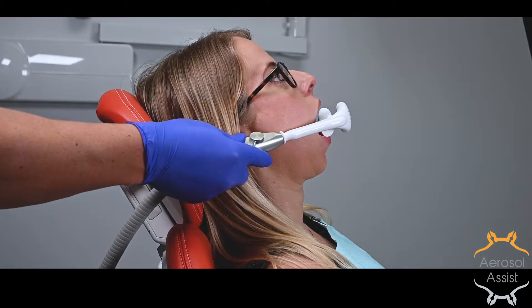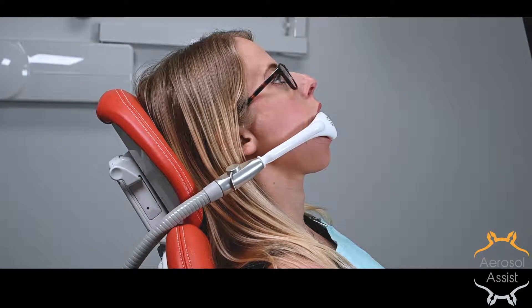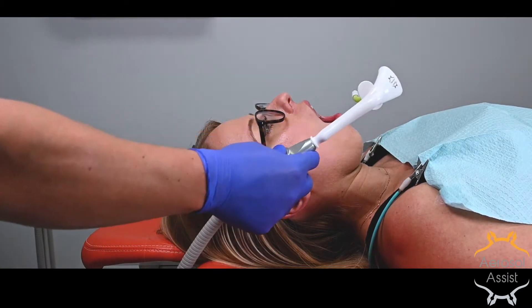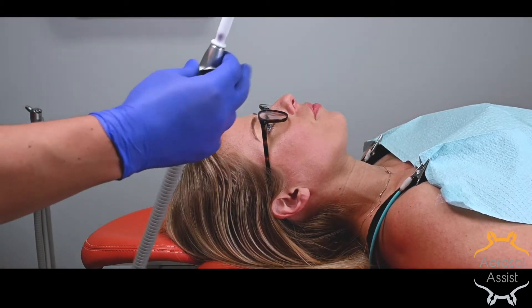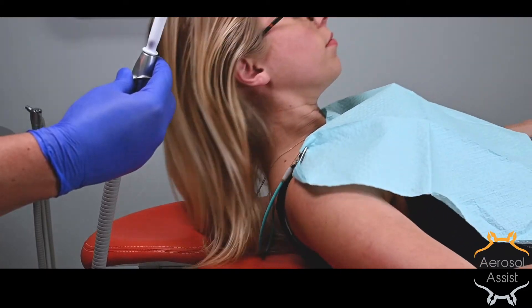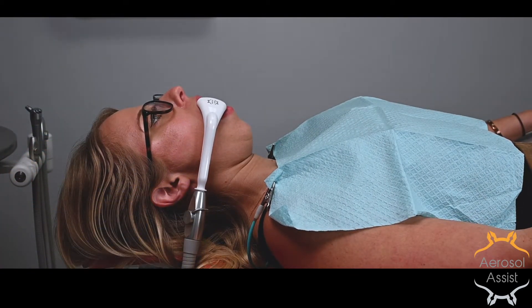Chair position is key to achieve predictable success. Any position that causes the HVE hose to bend will cause poorer performance. A supine position is best, making sure the patient's head lays on the headrest. This will decrease unnecessary tension on the HVE hose and the patient's anatomy.